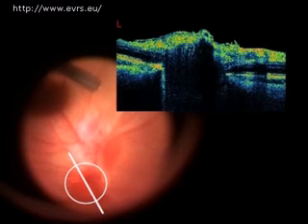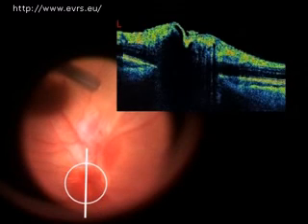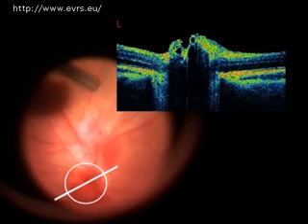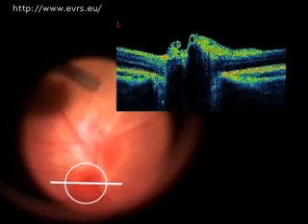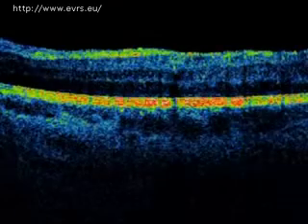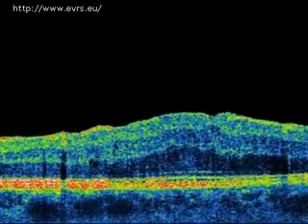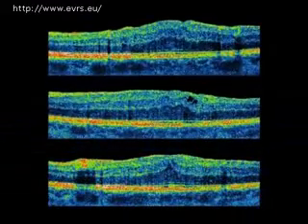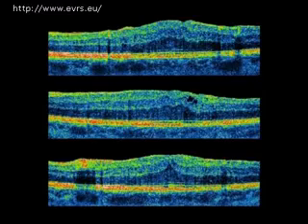Postoperative HRT and spectral OCT confirm our observations by presenting the pictures of the optic nerve head, upper vascular arcades and macula. Additionally, spectral OCT scans present edema of the macula without any epiretinal membranes, both in single and three-dimensional scans. Despite observed pathology in both eyes, 20/20 visual acuity was recorded 6 months postoperatively.